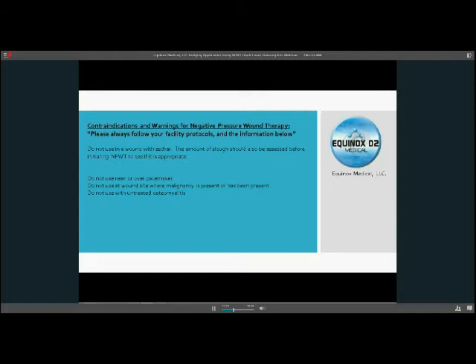If there's a certain amount of slough in a wound, you may be able to initiate negative pressure, but that will be up to your physician. It will also be up to your assessment on if it's actually too much slough in the wound. Negative pressure actually sets up like an autolytic debridement. So there is a certain amount of debridement that will go on because everything's kept contained, nice and moist and warm. So there will be some autolytic debridement that will happen with negative pressure as well.